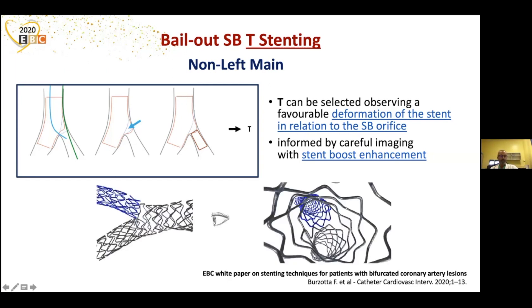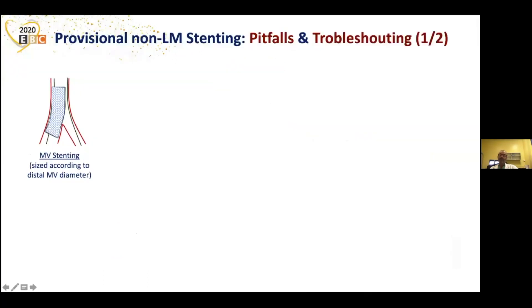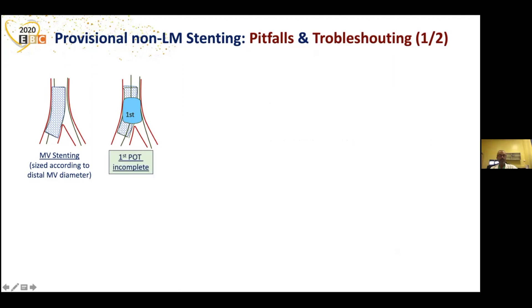Here is a possible scenario during a non-left main stenting. After implanting the main vessel stent according to the main vessel diameter, you do your POT — the first POT — but this is incomplete. This is the first pitfall I will show you, and the consequence of this pitfall.